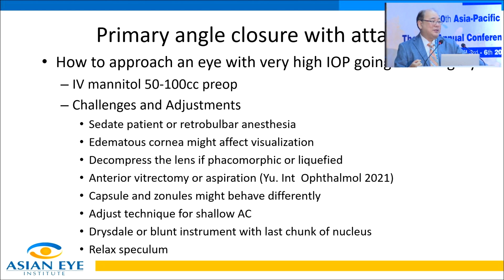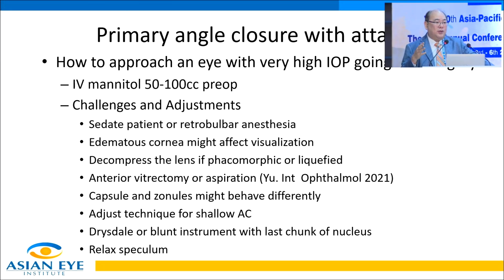And then I was taught in residency to put a lot of pressure. It's like you're mushing the eye, right? It's like you're squeezing the eye. We do that with corneal transplants too, right? We squeeze the eye so that you squeeze a little bit of pressure out of the eye. You may or may still not have an edematous cornea, and there was once where I had to de-epithelialize the corneal epithelium just to see what I'm doing.